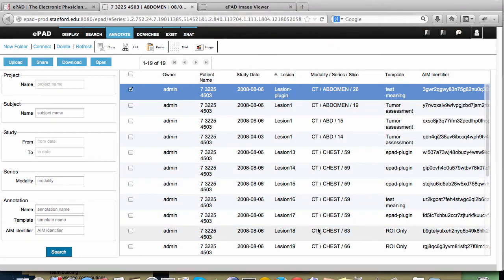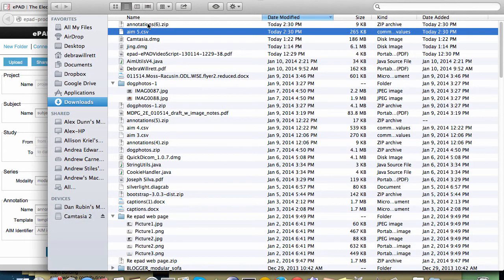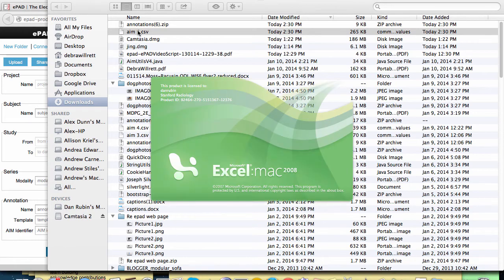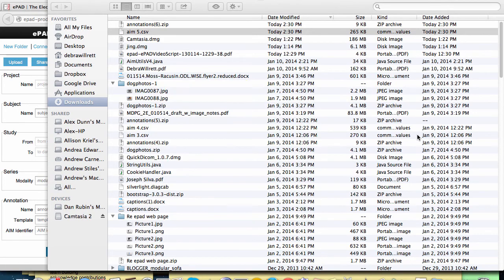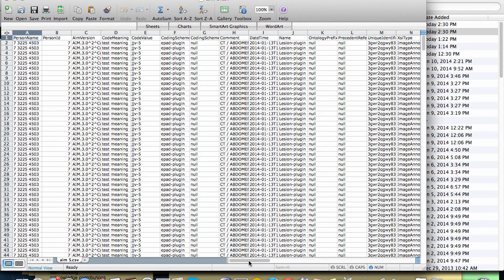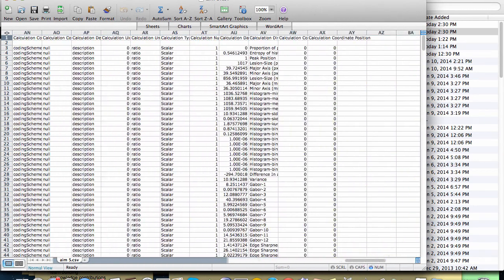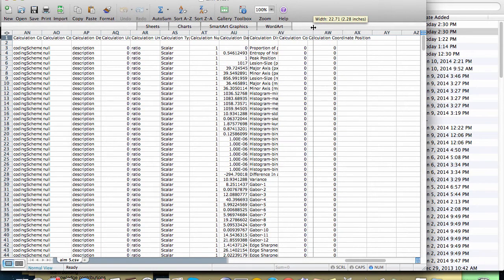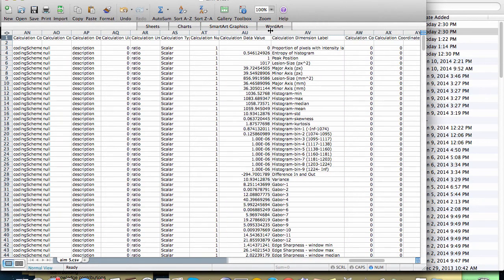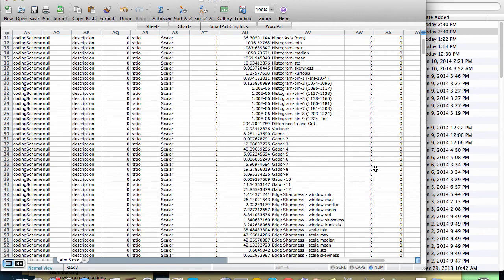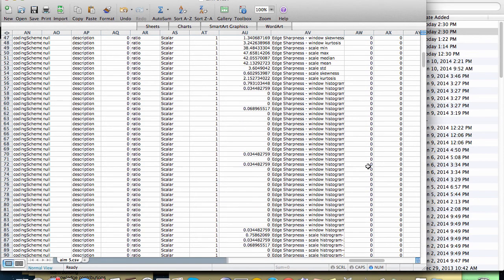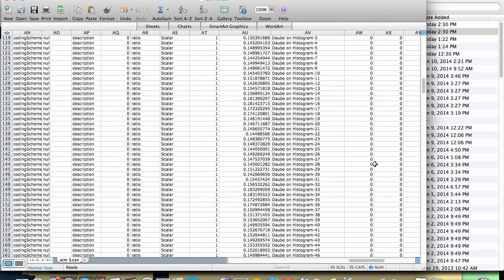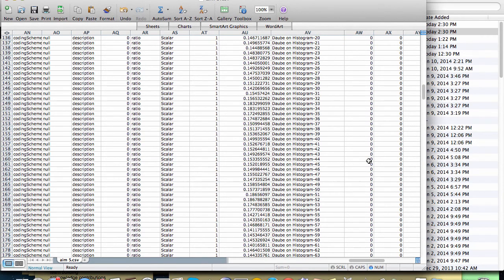Then I'm going to open this spreadsheet up and take a look at it. For the region of interest that I circled — the spline — I've calculated a number of feature vectors which include edge sharpness, shape, and texture. You can use this data to find other lesions from other patients with similar characteristics.